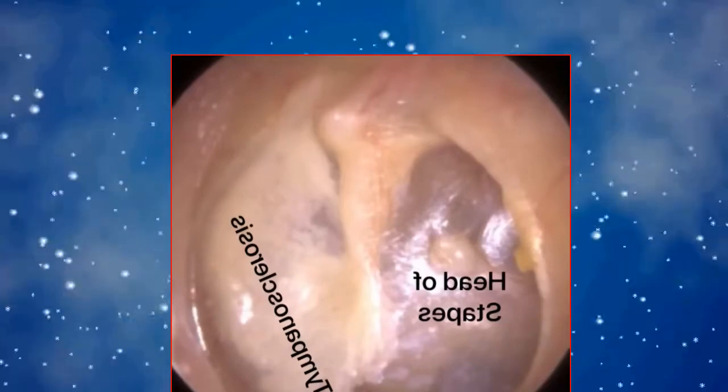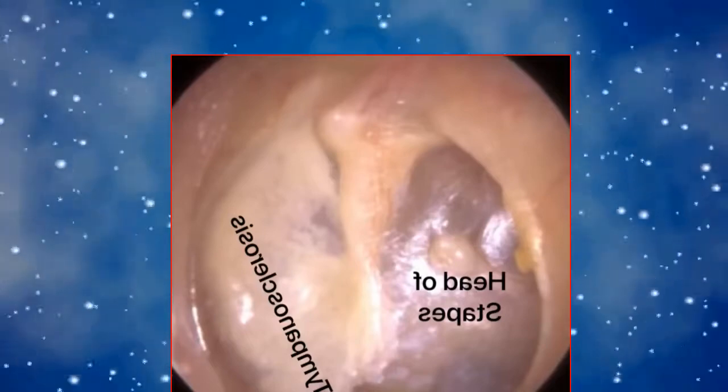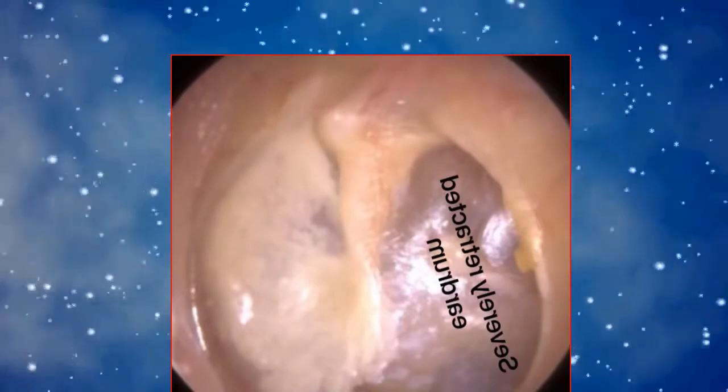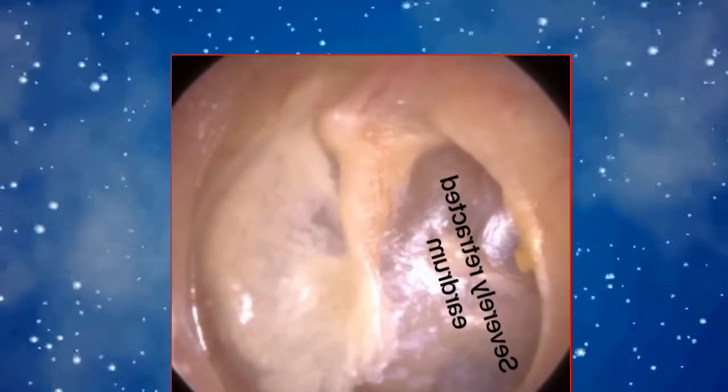The left-hand side, the eardrum, is not scarred, but it's severely sucked inwards. I don't know if you can see around the ridge on the left-hand side. So the patient has got a blocked eustachian tube. It's a long-standing problem. It's chronic. The patient has seen ENT before. There's not much more they can be able to do.